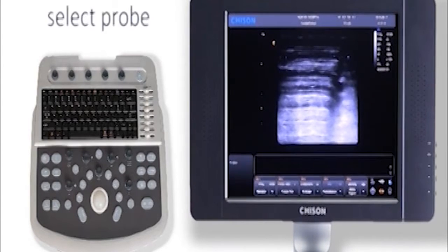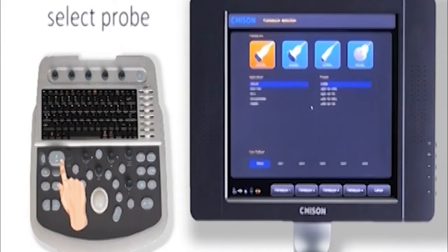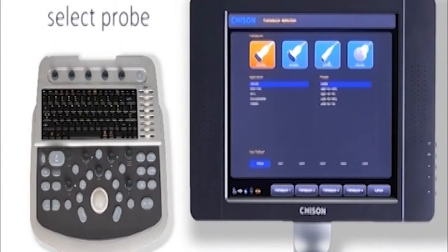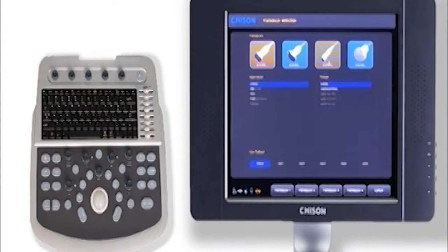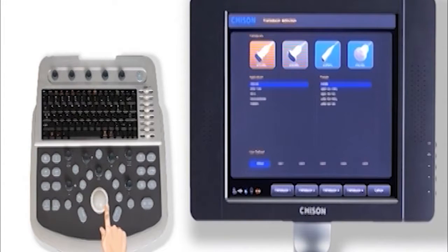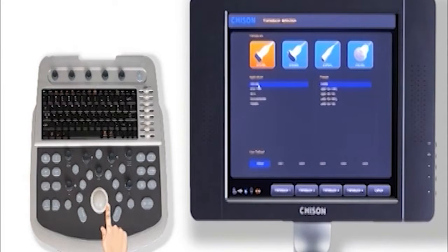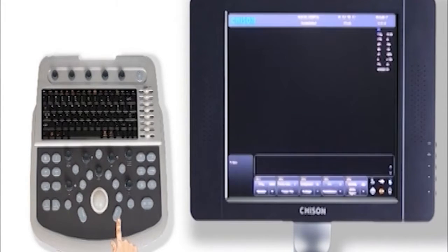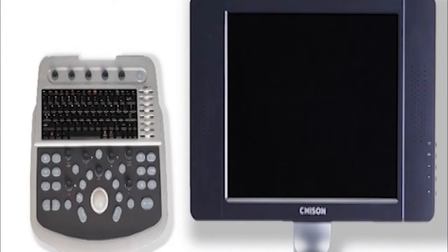Press the probe button to go back to the probe selection screen. Here's all the exams that are available. Roll the trackball to select the right probe, application, and preset, then double press the enter button to confirm and go to the imaging screen.